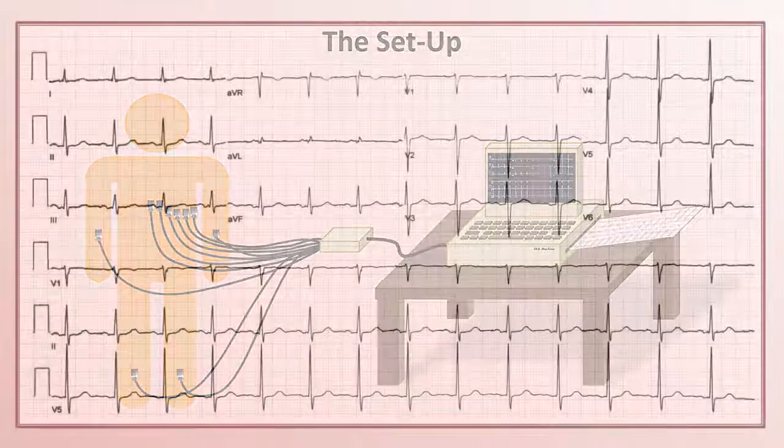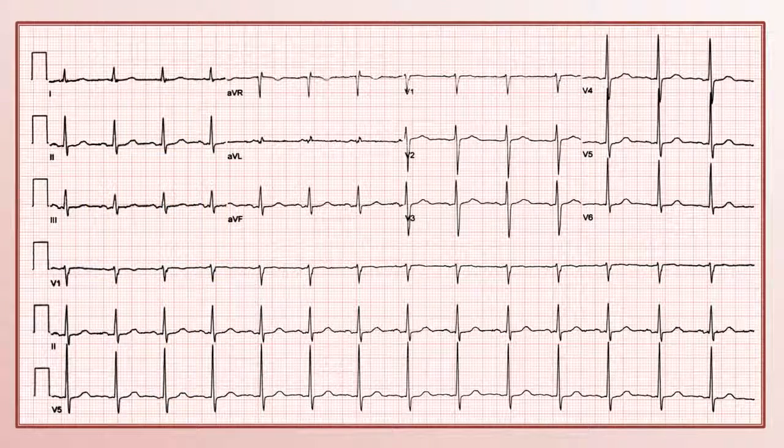Here is what a 12-lead EKG looks like. This is exactly what prints off the machine. In the separate lecture on EKG waveforms, I reviewed what electrophysiological event each of the individual little squiggles represents. Now let's talk about why the waveforms look different as one moves across the page. That's because as one moves across the page, the leads that are displayed change, typically every 2.5 seconds.